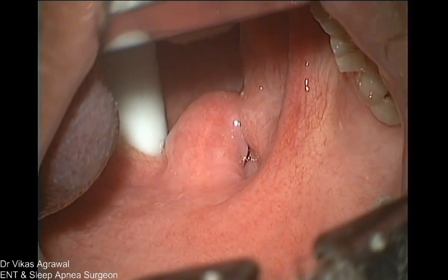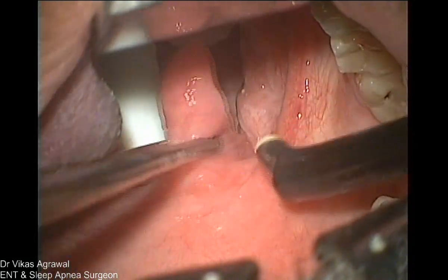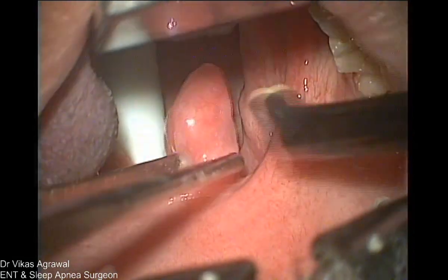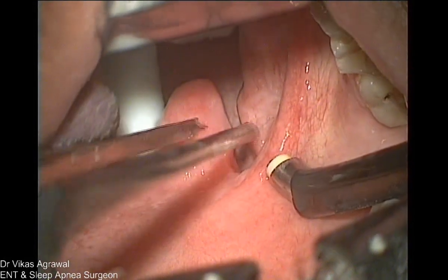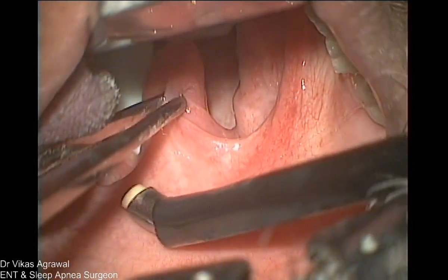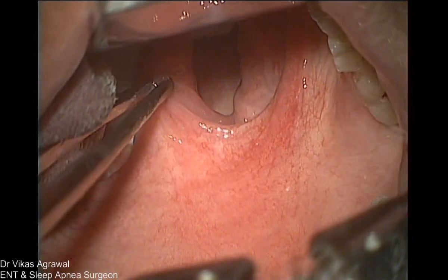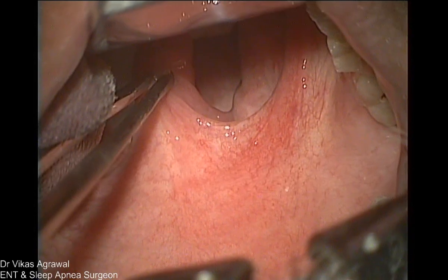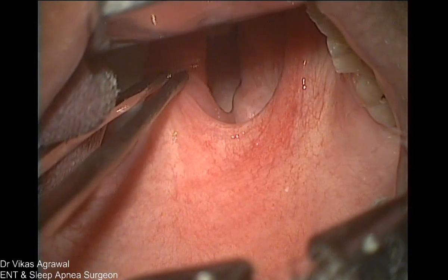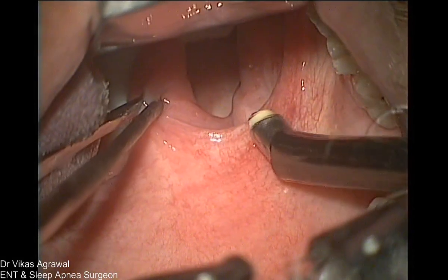So let me start with the same technique of palatal surgery. I'll be a little fast on the soft palate because we have already explained everything last time. So this is the anterior pillar, this is the posterior pillar, this is the tonsil, the uvula. So if we take anterior pillar to anterior pillar, the setting of coblator is 7 and 3.